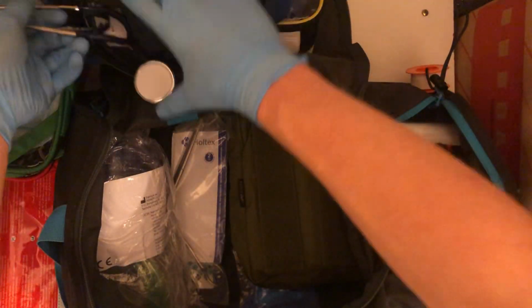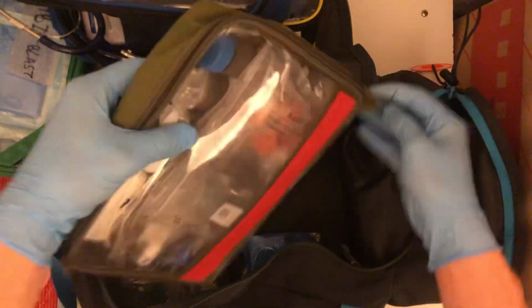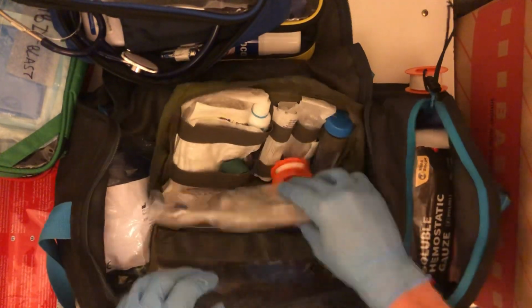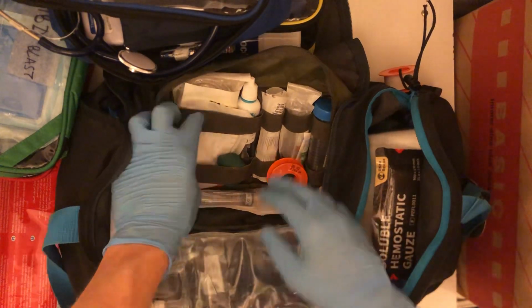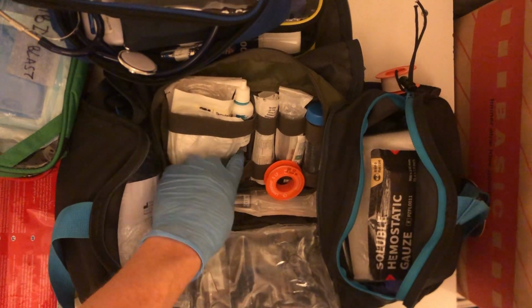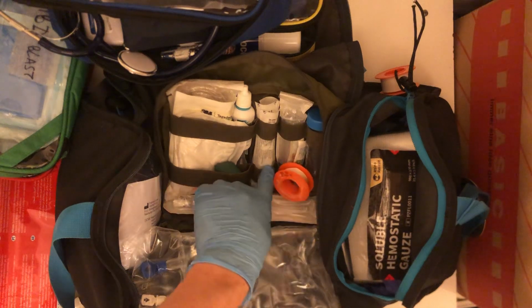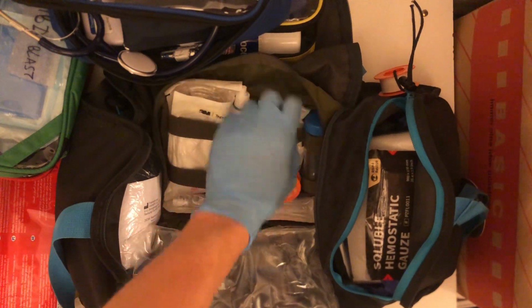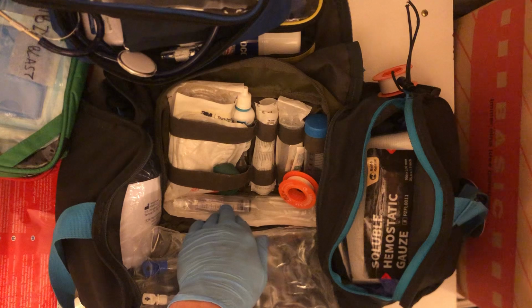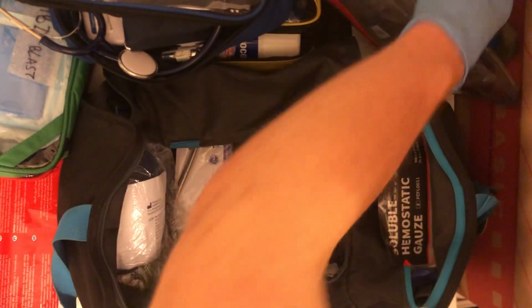Now as for the last pouch, it's intravenous supplies, for cases in which I'm going to start an IV, basically rehydration or hypovolemic shock, in which we're going to try and administer fluids. In this pouch I got everything I need to start an IV. I got gauze pads, a Tegaderm, tubing set, a disinfectant, normal saline in case I need a second flush, a tourniquet, so that's a venous tourniquet. I got a few catheters, 18 gauge and 20 gauge. Then I got a syringe with a few needles just in case, a sharps container, roll of tape, a saline flush, and a 500 mL bag of normal saline. And that's it for the pouches.